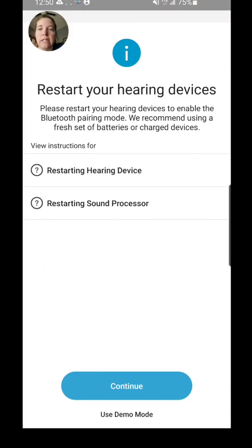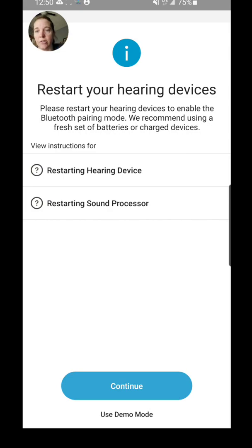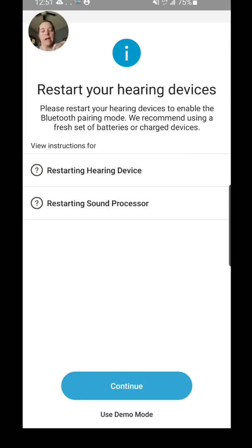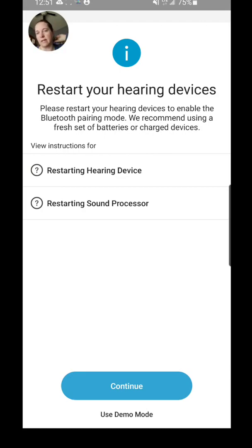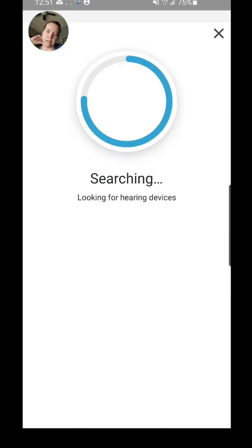The first thing that you're going to have to do is actually pair your devices with the app. The first step with this—and it actually tells you how to restart your devices—is simply opening up the pairing window by removing the battery from the processor and putting it back on. That opens the pairing window to allow you to pair to an app or anything Bluetooth essentially.